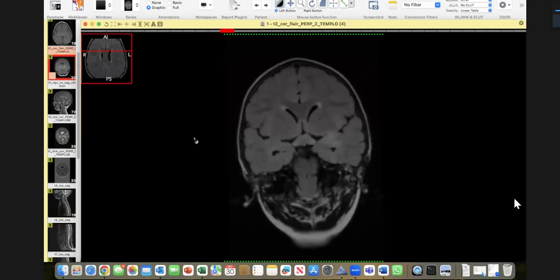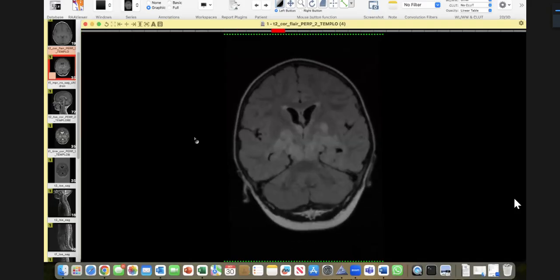I had selected some questions for you, and in the exam also, they will select one or two odd questions for you. But if you don't reach that point, they cannot ask that question and they might go to the next case. And you are going to lose marks in some of the domains which I have told you. So this was NF1.